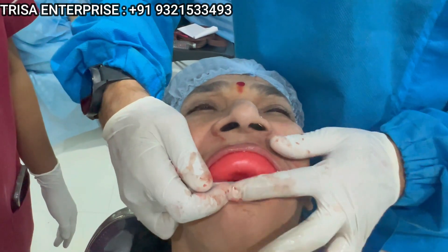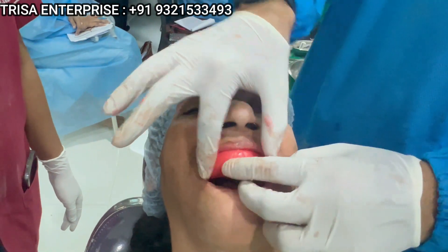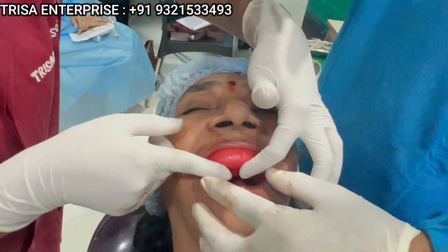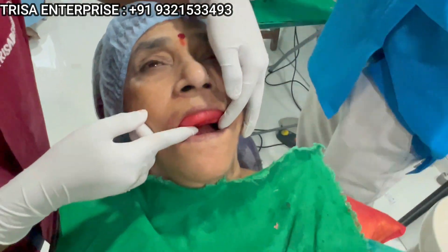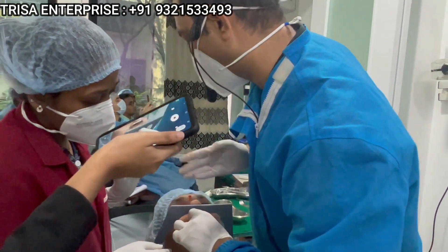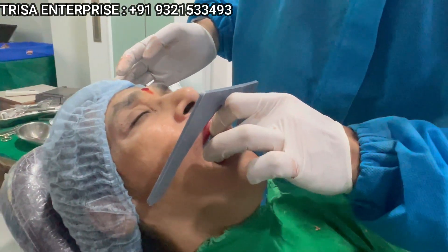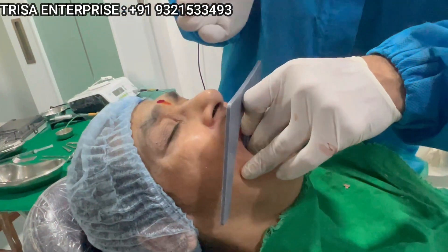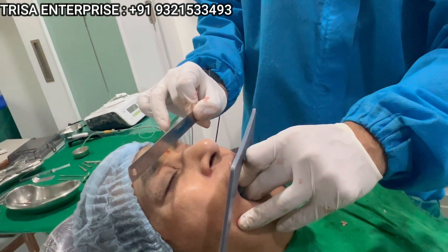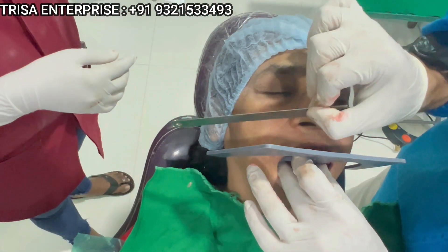I'm using the lip to get lip support. Now I will use my fox plate, which we have all used during complete dentures, and my assistant will stabilize the wax ring. You take your fox plate and place it in the patient's mouth. If you want, you can draw your ala-tragus line as we used to do, and you make your plane parallel to the ala-tragus line.